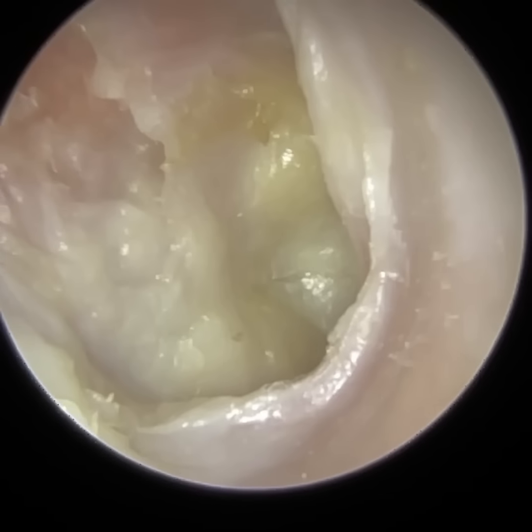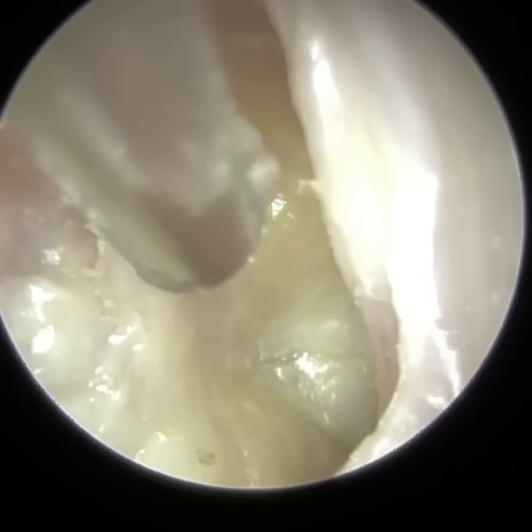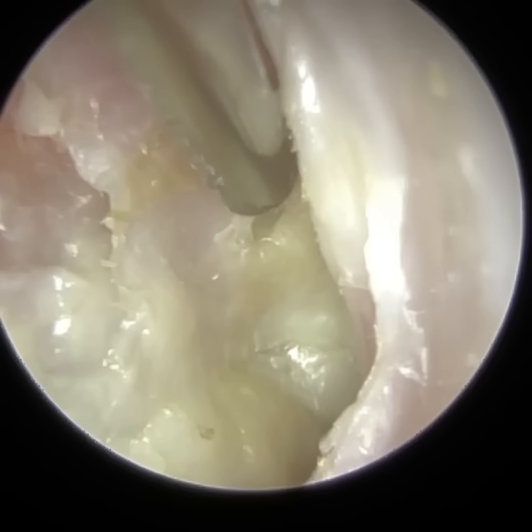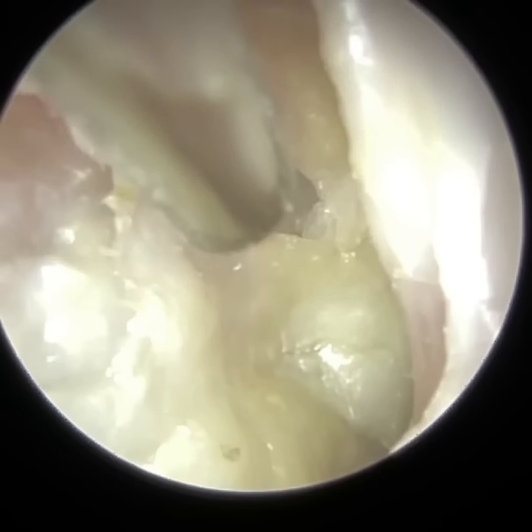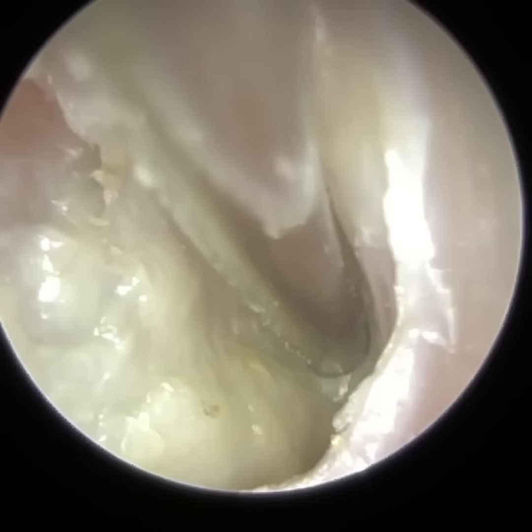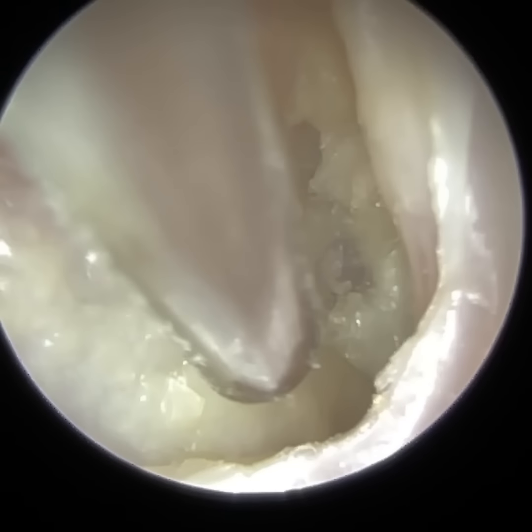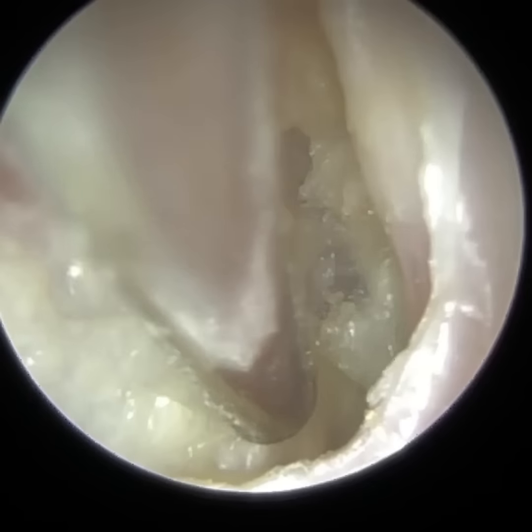So with a 14 gauge suction tip, it's just a bit too big, not as delicate as a fine end. Now with the fine end, I've changed the size that I use. Many of you know Connor Boland of Durham Hearing Specialist. He visited the clinic last week or the week before, and I've got him trained up on the wax scope. I spoke to him yesterday, and he said he's got a great video to upload shortly, so I'm eagerly anticipating that.